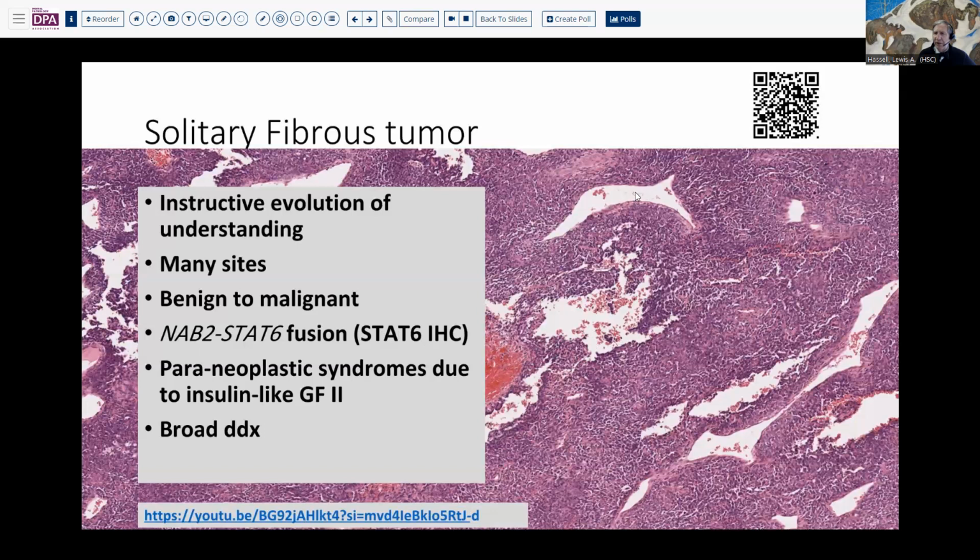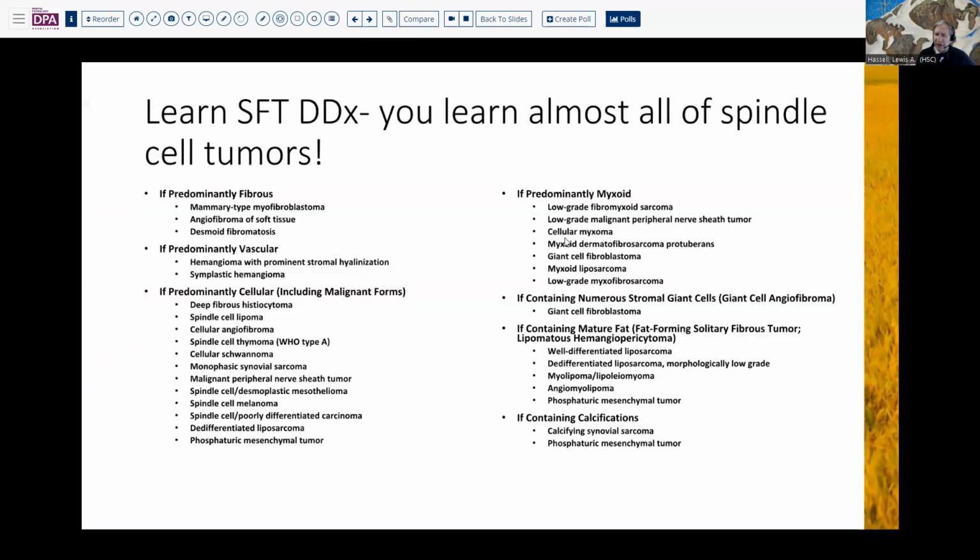Here's a nice video talking about some of these other cases, but I also have included here several examples, including a couple of malignant examples for you to consider, and that's what that QR code will link to. But I think the instructive thing is that, you know, if you learn the differential diagnosis for solitary fibrous tumor in its various morphologic types, you'll really learn almost all of spindle cell tumors. Tremendous amount of information can be gleaned from just considering what these various differentials include.